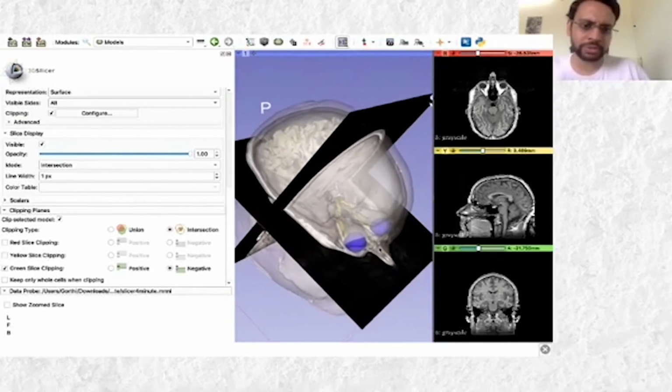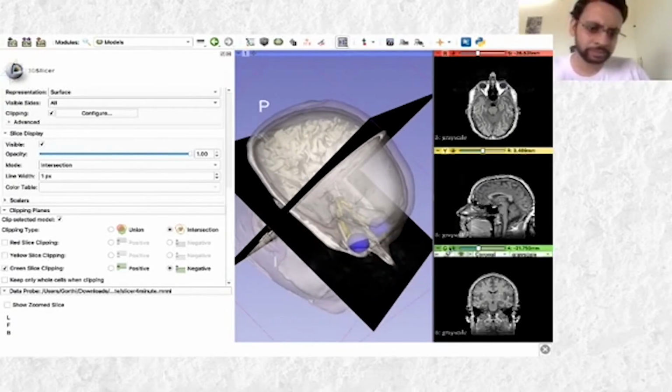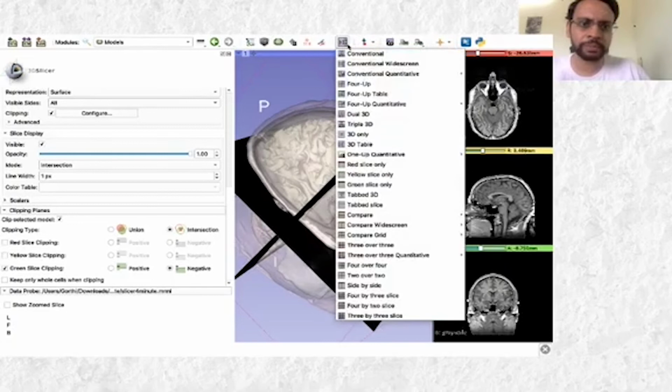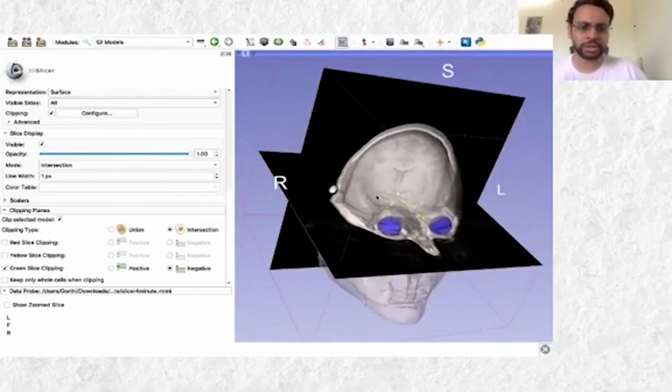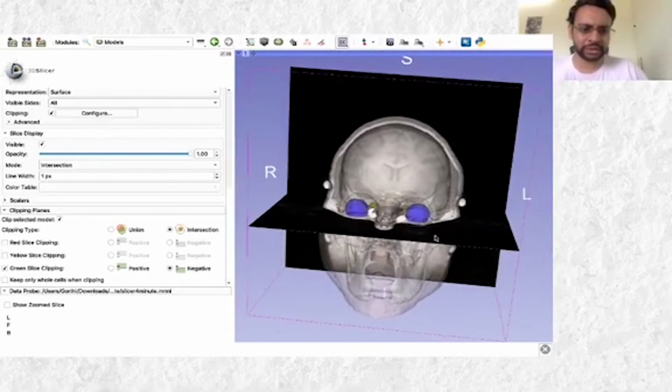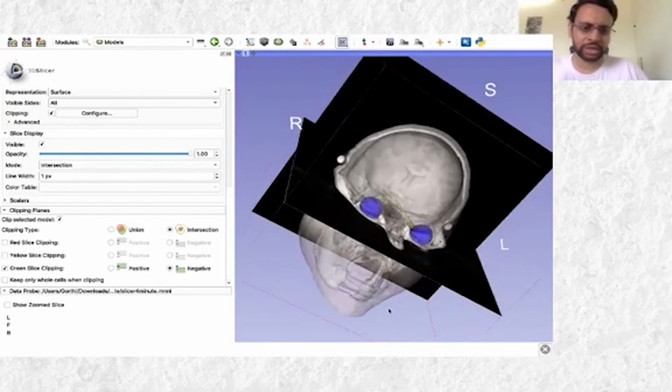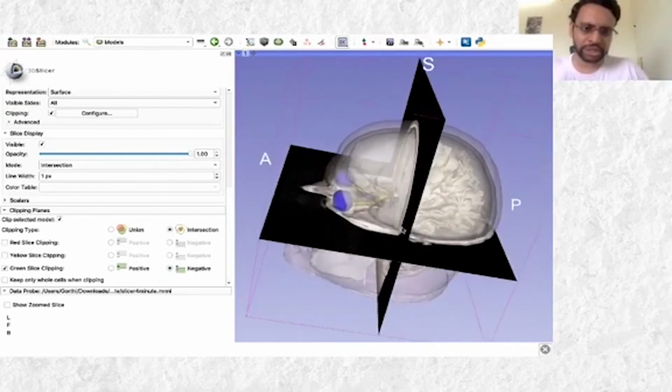See how it is visible here. I could further come down a bit and again come back here to just the 3D volume. See how nicely I could see that here. That's the optic chiasm, and I had control over what I could see here.